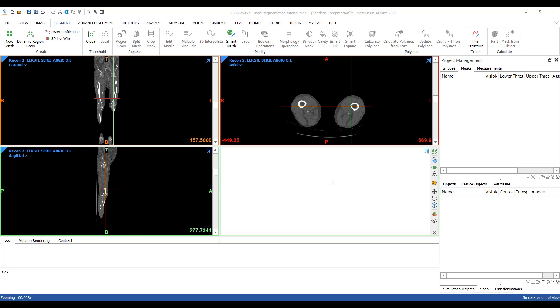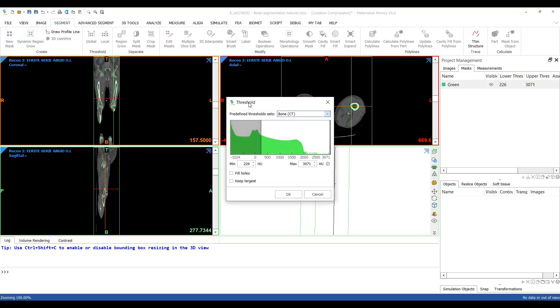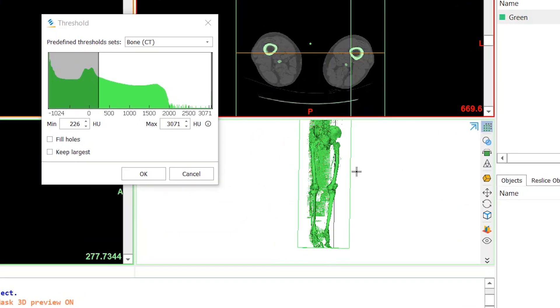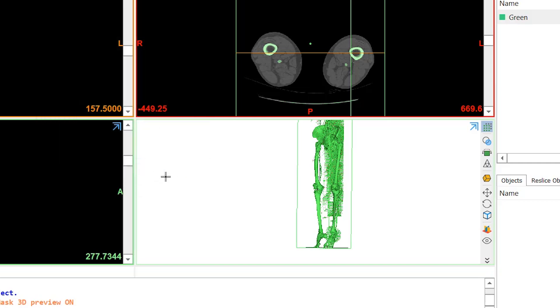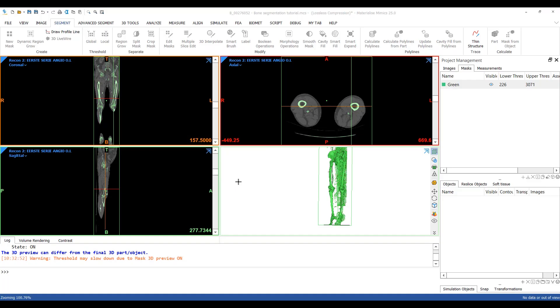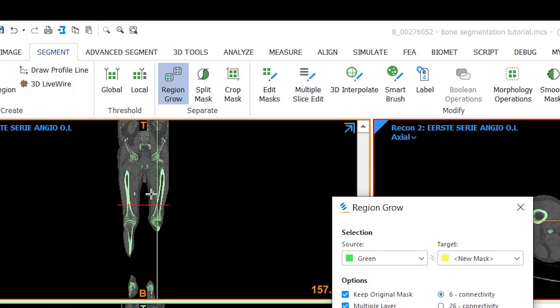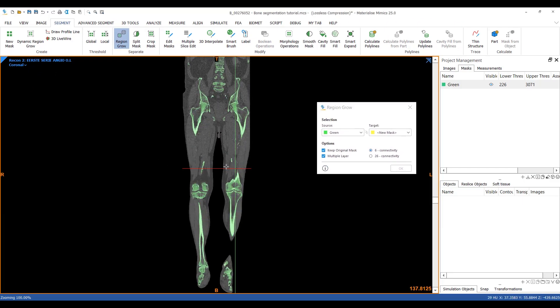I'll start by going to the segment tab and selecting new mask. Here I'll define an initial threshold for my region of interest and I can preview this threshold by activating the 3D mask preview, then click OK to confirm. Now there are some parts included in the mask that I'm not interested in, so I'm going to use the region grow tool to indicate the parts that I want to keep.